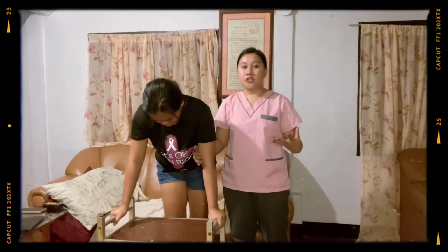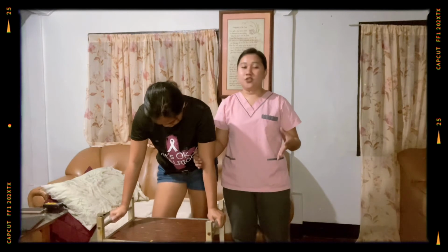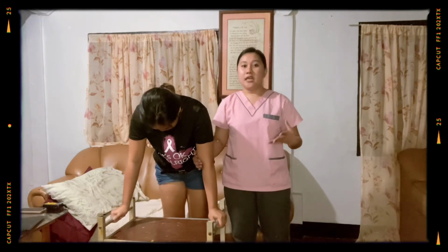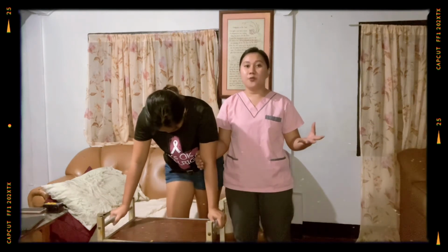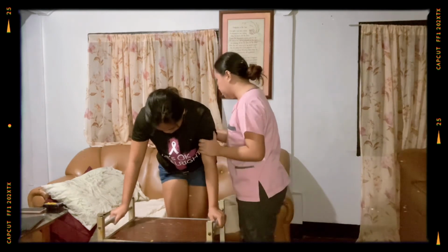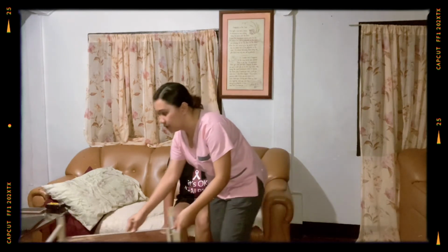So, return the patient to the bed or chair based on the patient's tolerance and condition, ensuring that the patient is comfortable. Make sure call bell and other necessary items are within easy reach. So, ma'am, we are going to put you back. So, this is the call bell, ma'am, ha? Butang na ako siya dali. So, by moving the walker, this promotes activity continuing for the planned distance and time and prevents the patient from becoming fatigued. So, I'm going to move the walker now.